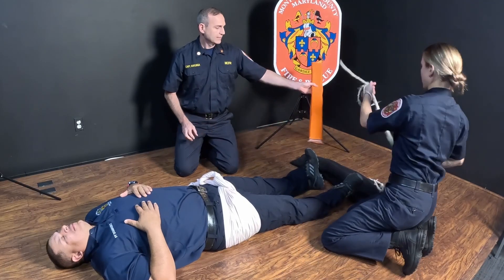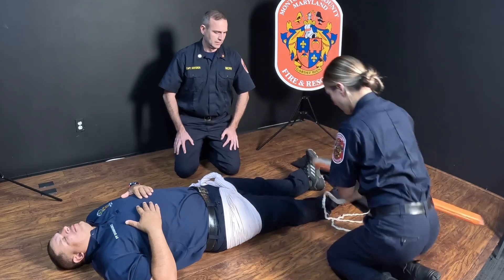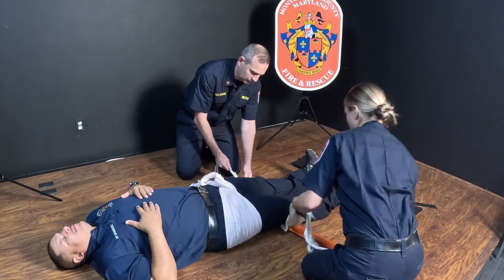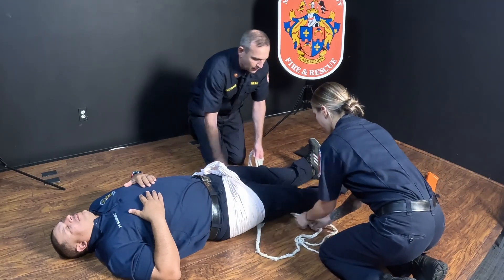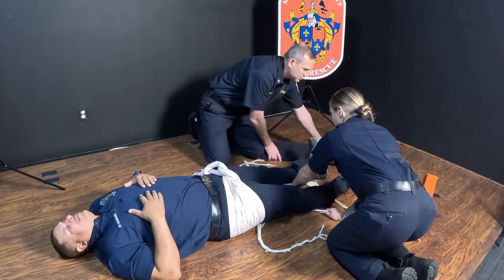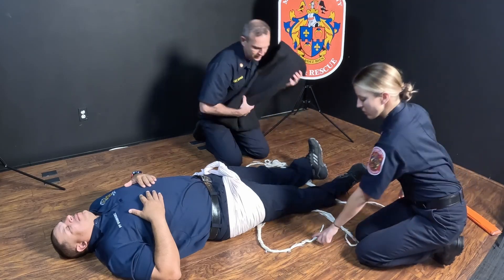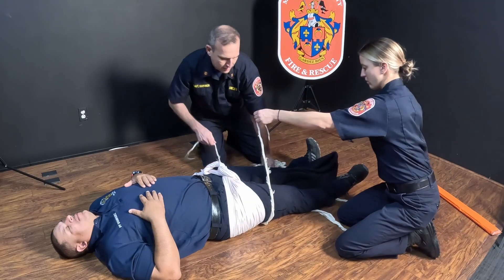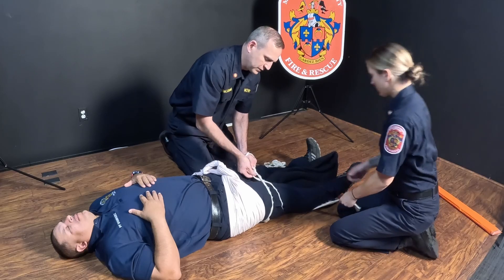We'll then take three cravats and slide them under the patient's knees. One cravat goes above the knees, and the other two cravats go below the knees, similar to the pelvic splint. We will fold the blanket in between the patient's legs, and going proximal to distal, we will tie our cravats.